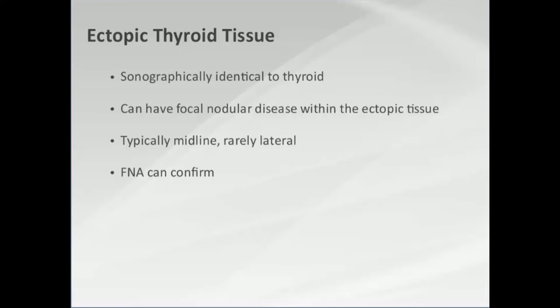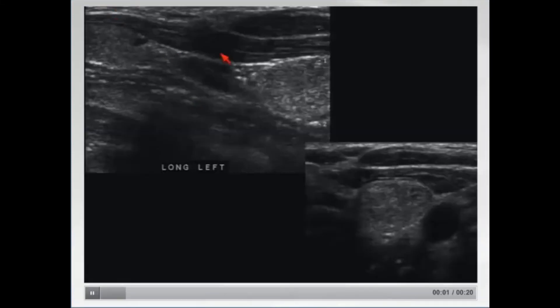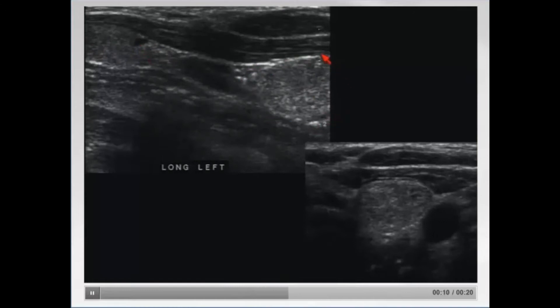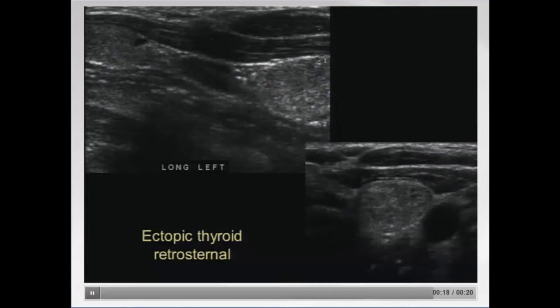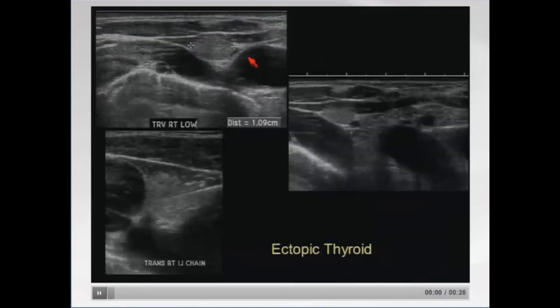You can stick a needle in it and confirm that you're looking at thyroid tissue. Here's a patient with a mass in the upper part of their neck, sort of in the sternal notch. This is the normal thyroid here, and here's the abnormal tissue, sonographically very similar to the gland. Here it is transversely, and that was proven to be ectopic thyroid in a retrosternal location.